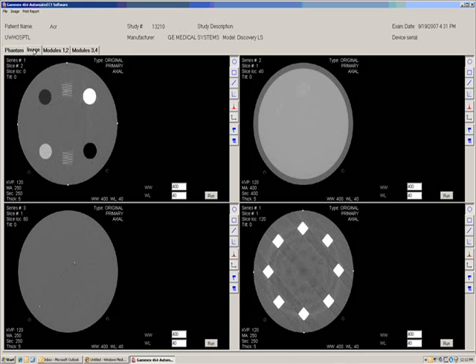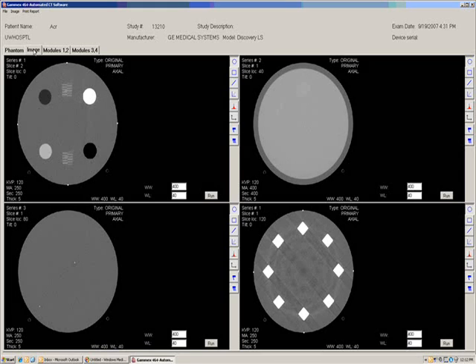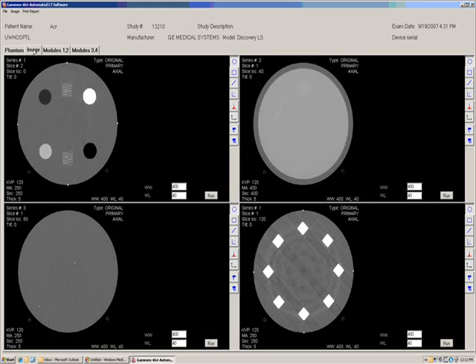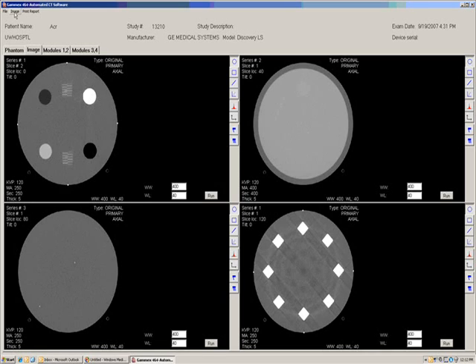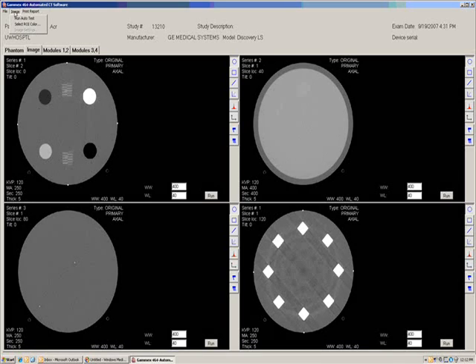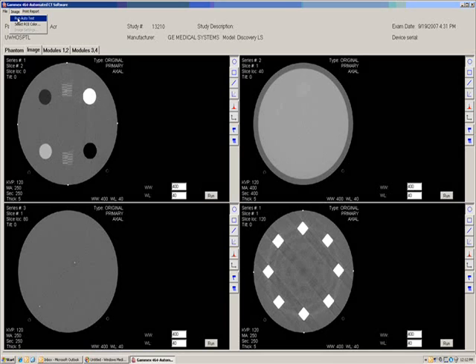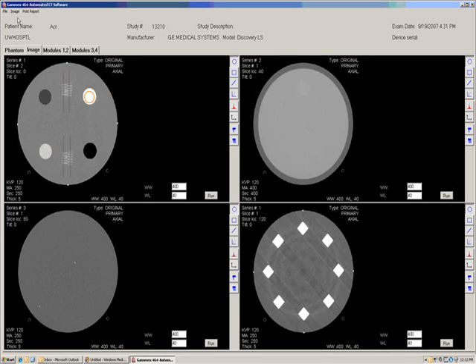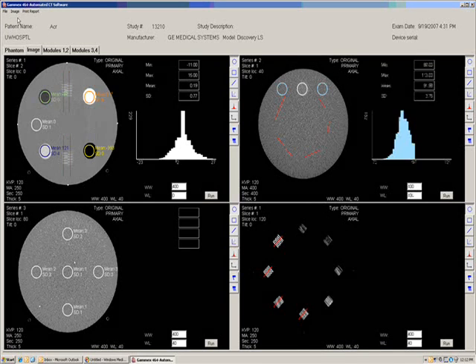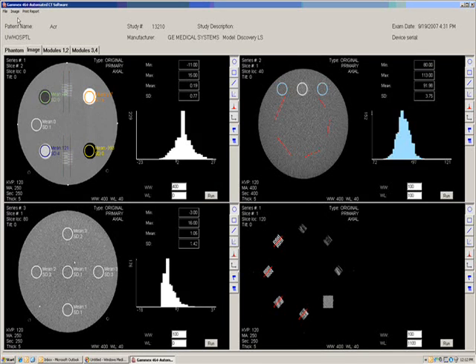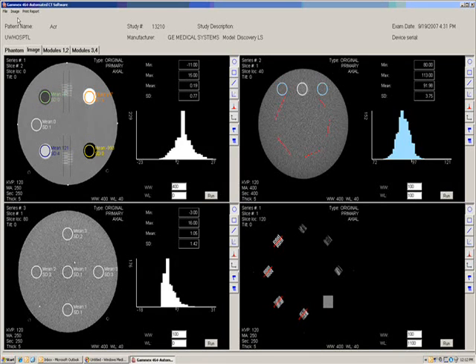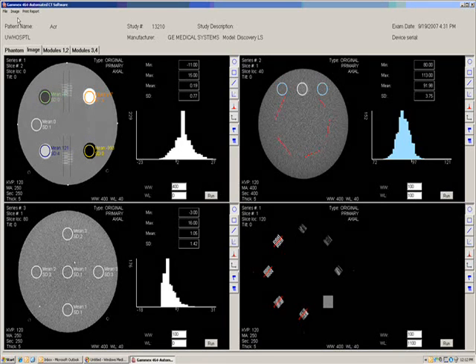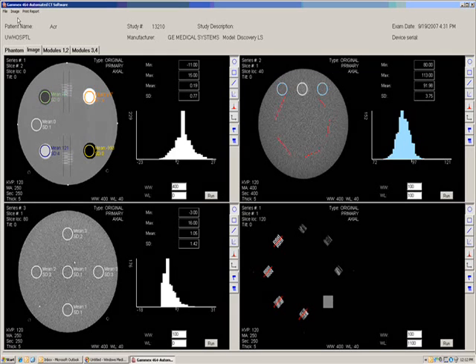Once the images are displayed and look satisfactory, then the analysis is performed by selecting Auto Test on the pull-down menu under the Image button. In a couple of seconds, the test results appear. All the ROI selections are automatically positioned according to the ACR instructions as well as linear measurements for spatial resolution and slice thickness.